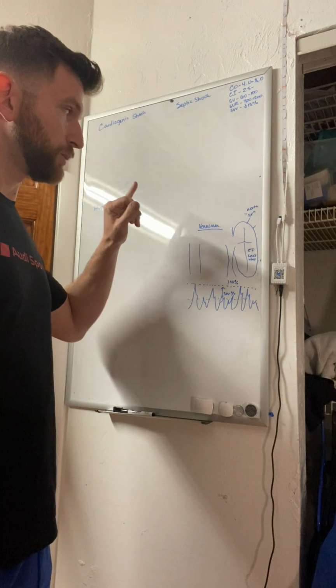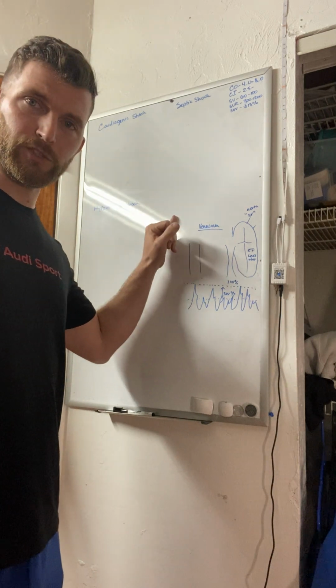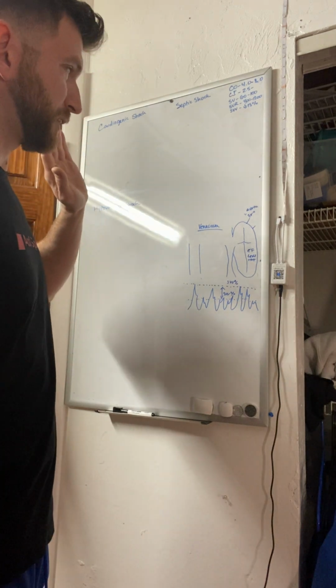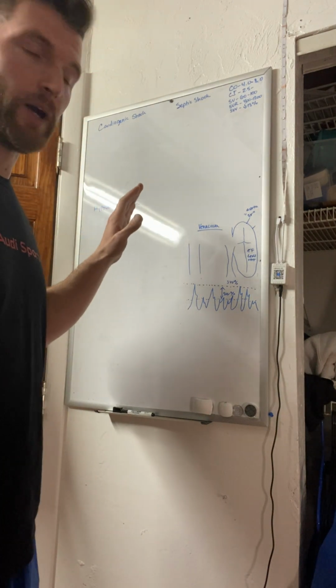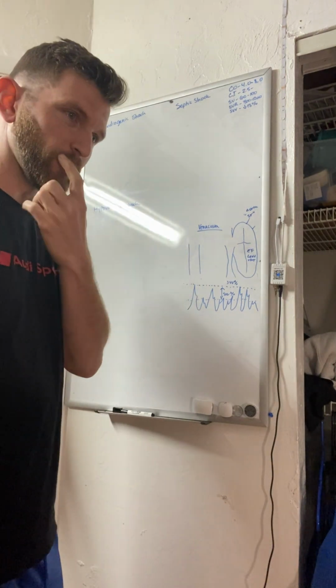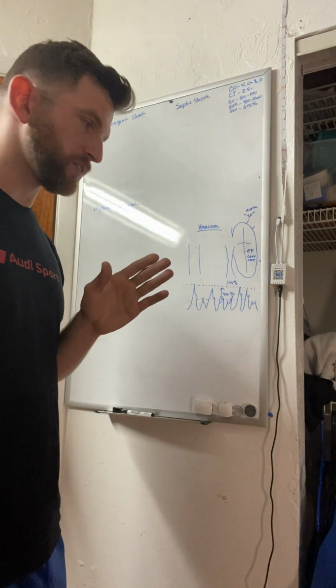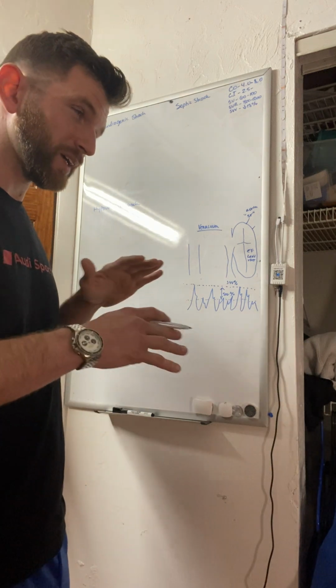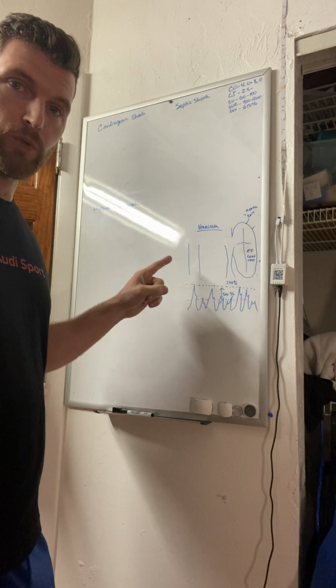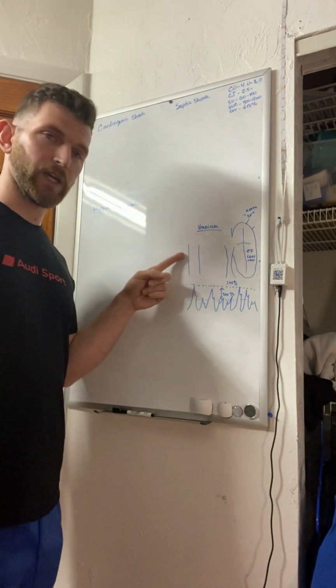But I'm going to teach you, in the ideal situation with the ideal factors in place, kind of the quick and dirty. All right, so we'll start with understanding SVV. I feel like if you understand SVV, at least the way that I think about it, it can be very helpful. So right here you have a normal vena cava, right?